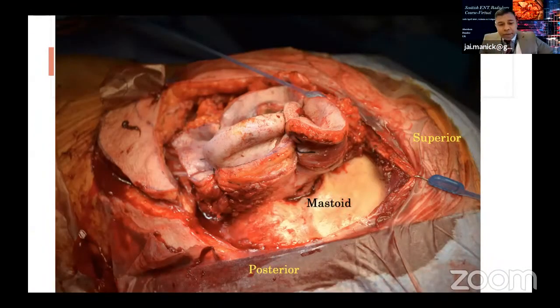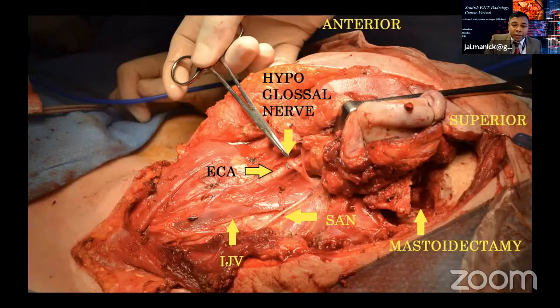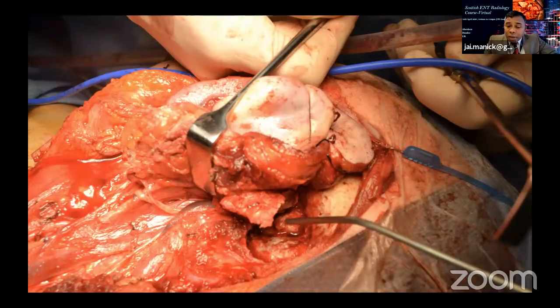So this patient had a lateral temporal bone resection. We started with the mastoid with the help of the otologist, trying to do an en bloc resection, and then the neck dissection, preserving the IJV and the spinal accessory, and we're trying to come across the hypoglossal nerve, clearing the inferior bit, and coming to the posterior bit. The patient is undergoing mastoidectomy, a combined approach tympanoplasty, to remove the ear canal en bloc.